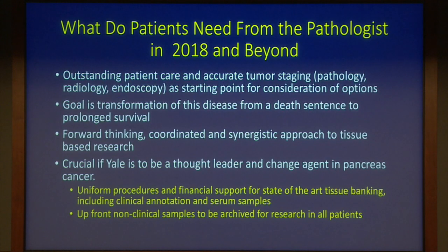And if you're dealing with a small biopsy, we need 4 slices to do these sets of stains. And so one can easily imagine that if we do those 4, it means we may not be able to do something else on this tissue later on. And finally, this is my last slide. So these are just some considerations as we get into the nitty-gritty of modern therapeutic options.